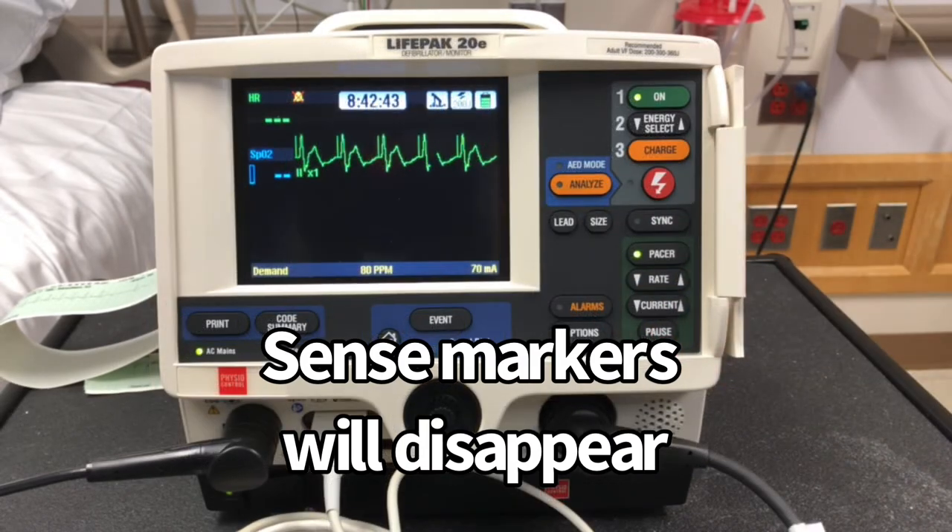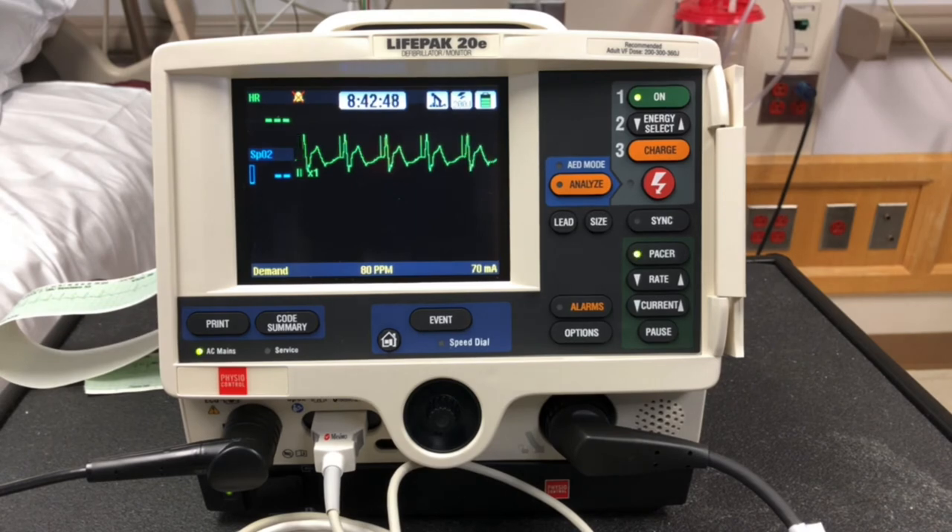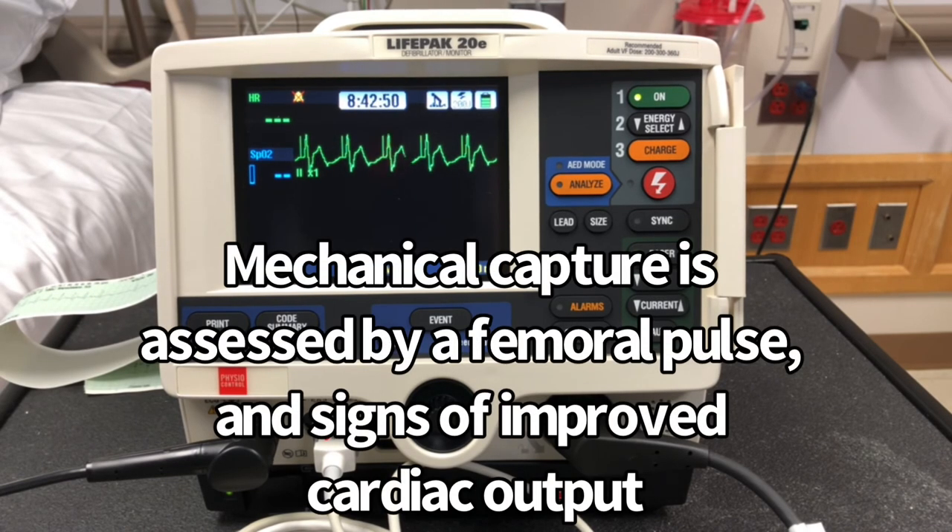Once we have electrical capture, as shown by the pacer spike before the QRS, we want to make sure we have mechanical capture by assessing the patient, making sure there's a pulse and vital signs are stable.